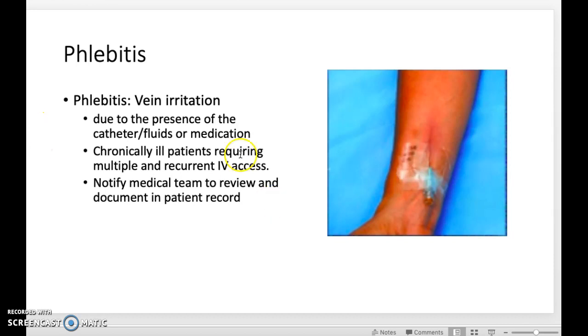The last, I don't have a picture of, is catheter embolism. It's very rare. It occurs when a piece of catheter is severed and enters the circulation. Defective catheter or sheared catheter. Again, I've never seen it, but just make sure that when putting in a catheter, the product has integrity and that there are no broken pieces. That's really it.